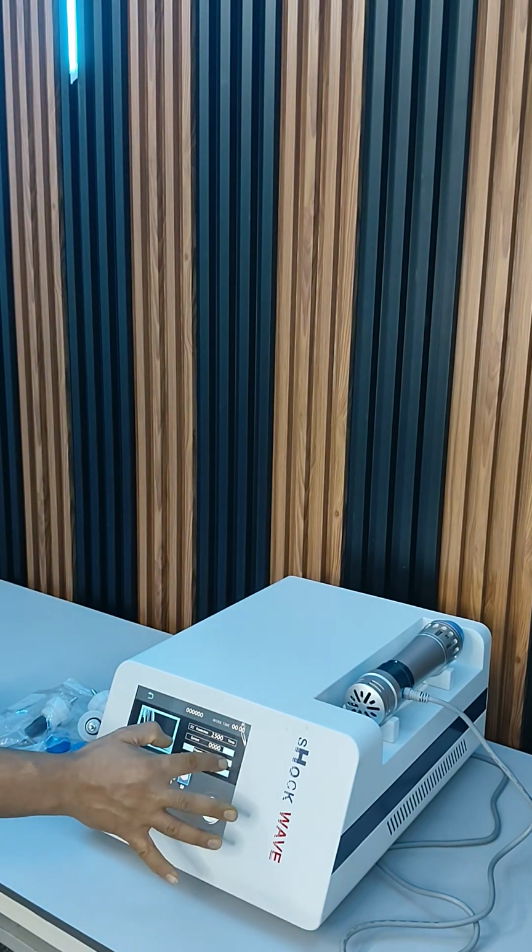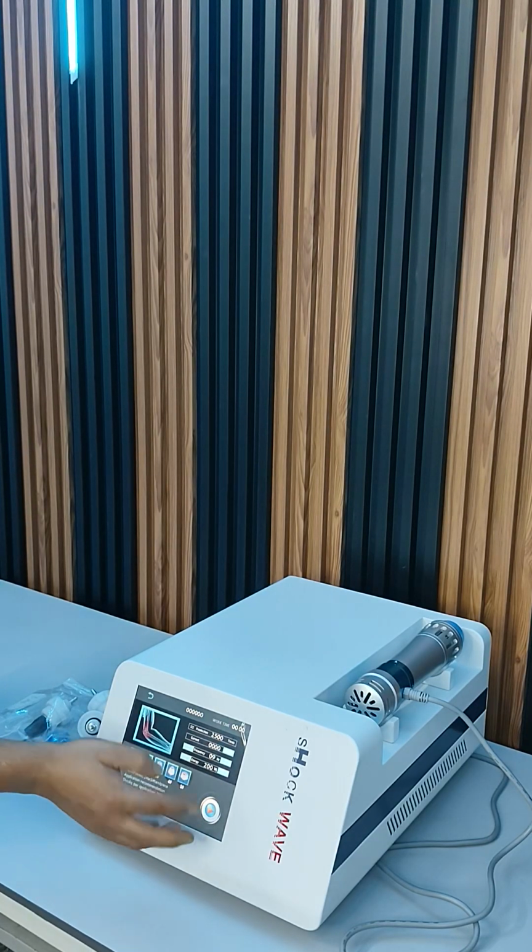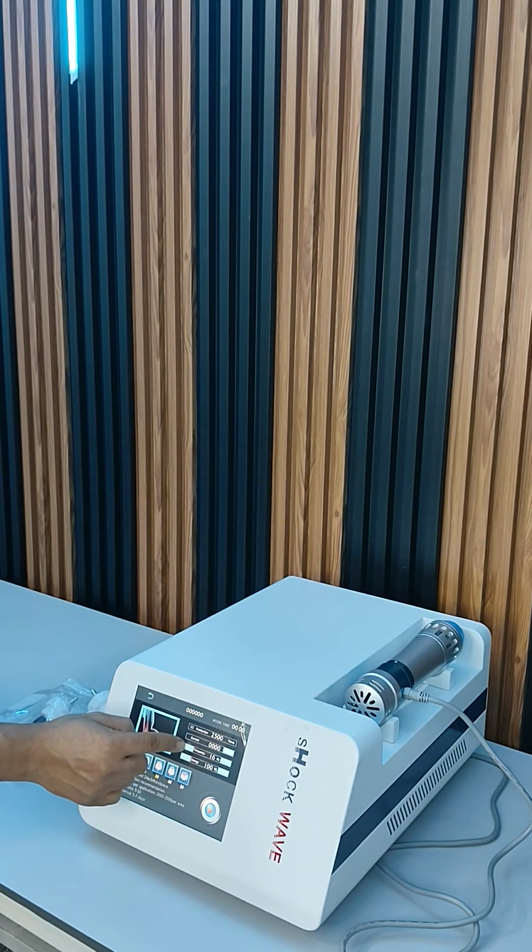Like if I select 8, I can go up to 200. But if I select 15, 16, because these are the last two frequencies, the energy is limited.